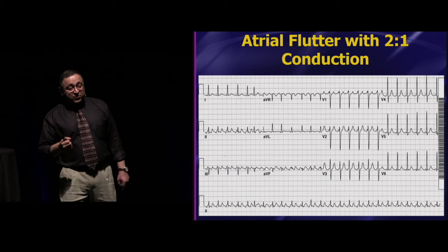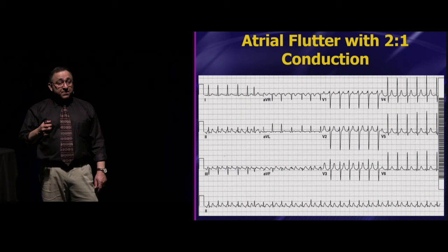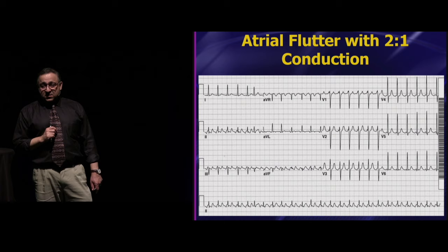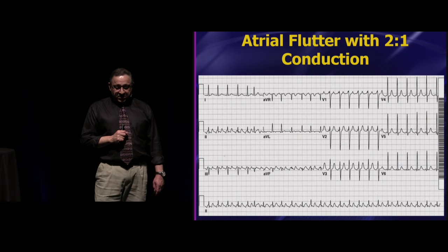All right. I'm not saying you only look at V1. Look in all of the leads. You've paid for all 12 leads, so use them all. Look at all of them. But V1 is always the first lead I look at when I'm trying to figure out if they're P waves or not. All right. Sometimes P waves are only present in one lead, and oftentimes it's just V1. Anyway, that's an aside. We'll come back to that a little bit more later on as well.